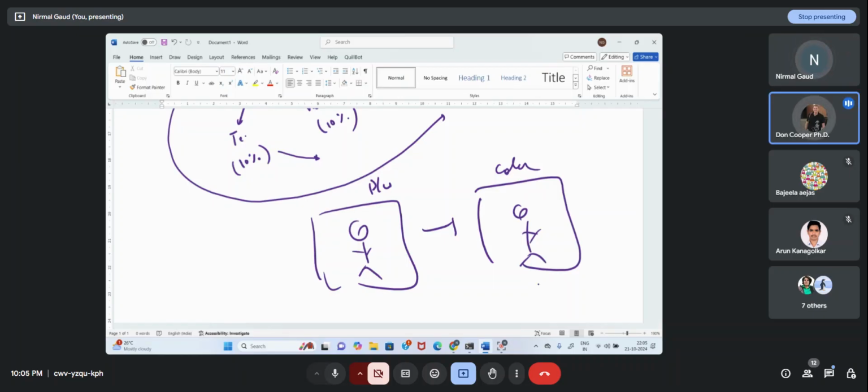If the converting original image was something acquired in black and white, each channel was collapsed into black and white, into grayscale. So unless it's pseudo color, you can't create more information than what was originally acquired. Okay. That means you're saying the channels are fixed. If the image is grayscale, it will remain grayscale. Doesn't matter. You change the mode of processing those images.